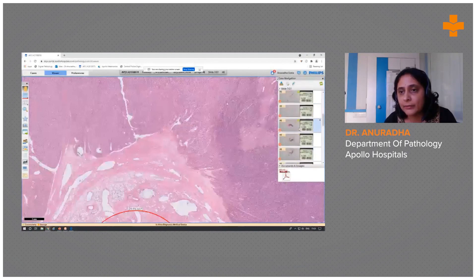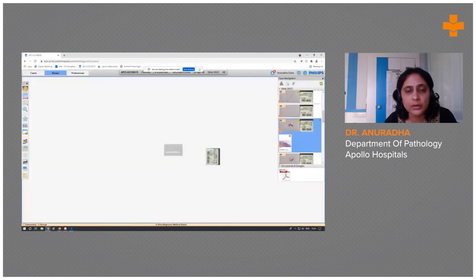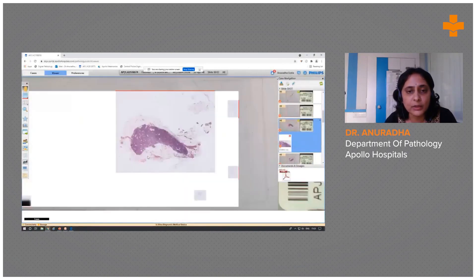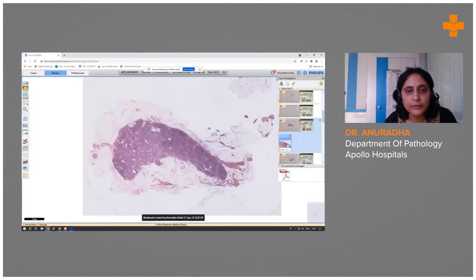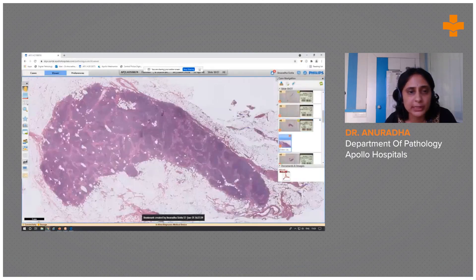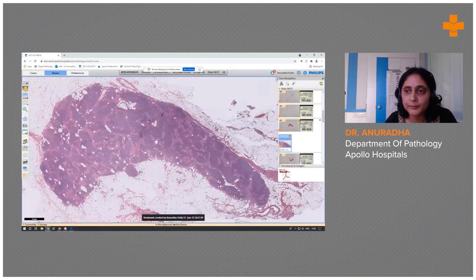We also dissected out some hilar lymph nodes. On closer view, they are free of tumor.